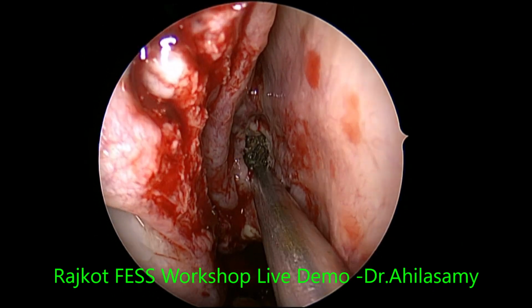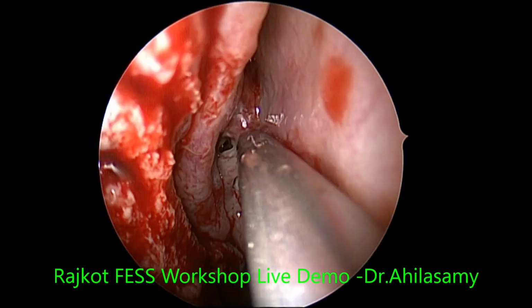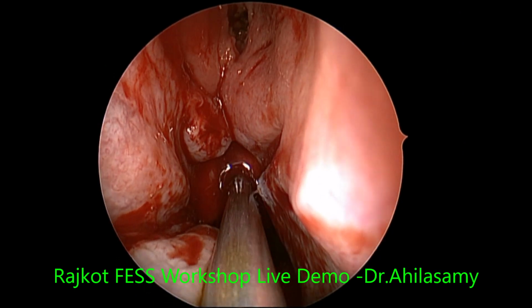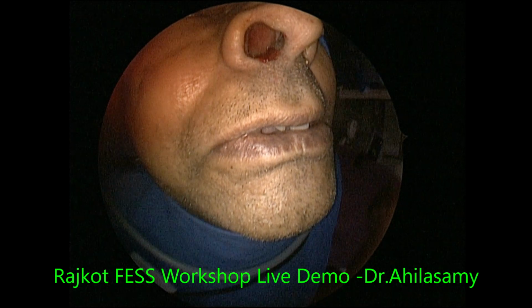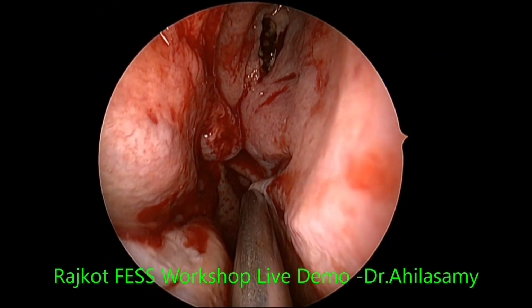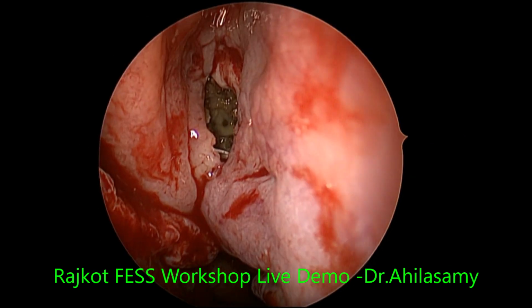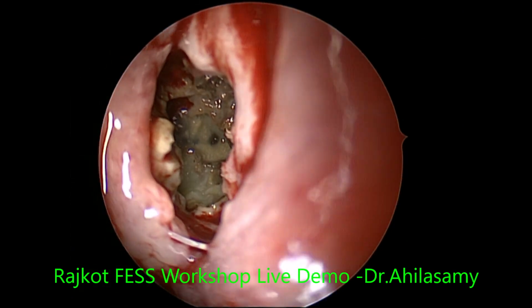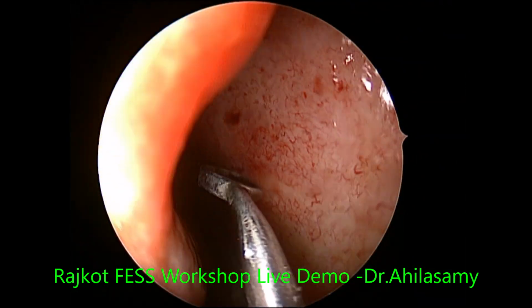I am sucking it out. See, with the pressure itself, see how big the opening is made without losing any mucosa. As far as possible, prevent mucosal damage and mucosal stripping, and that will prevent future fibrosis and future stenosis. See, full of fungal material within the sinus. Hardly any bleeding. You can appreciate the field very well.